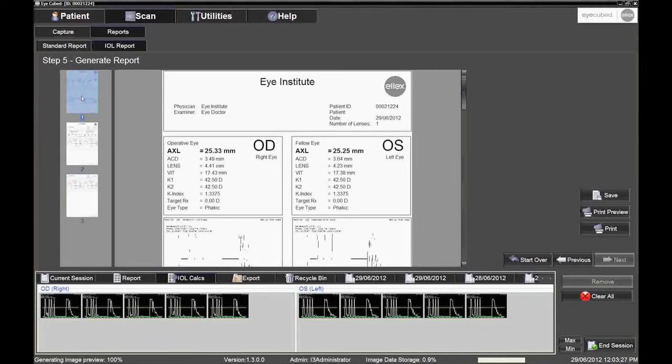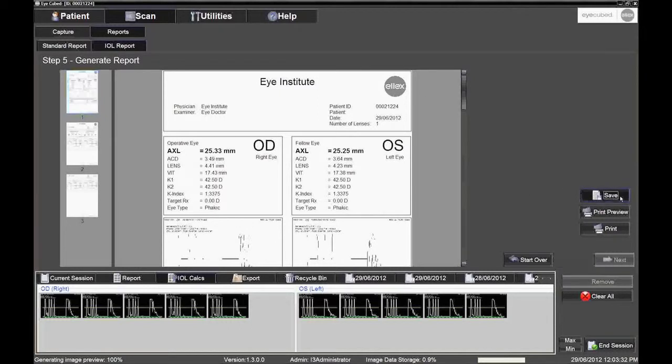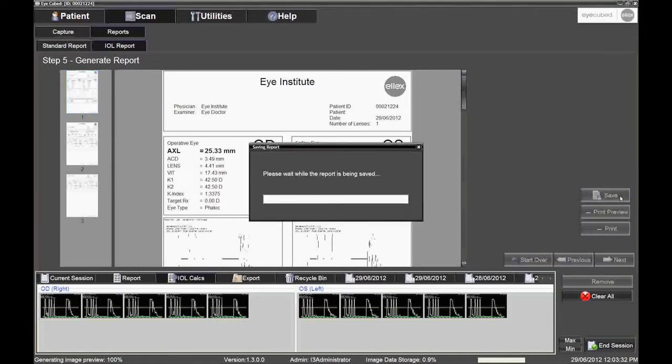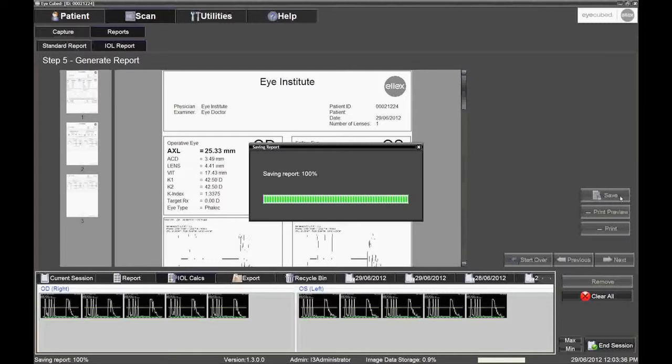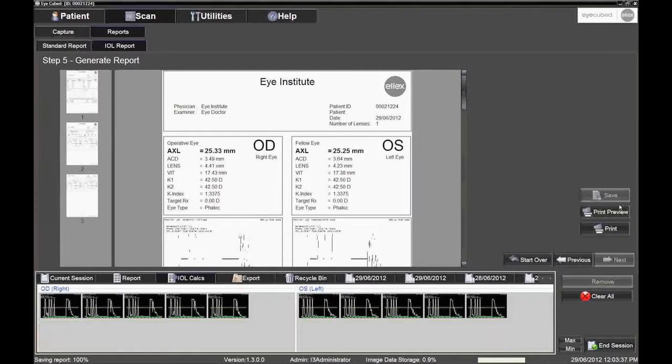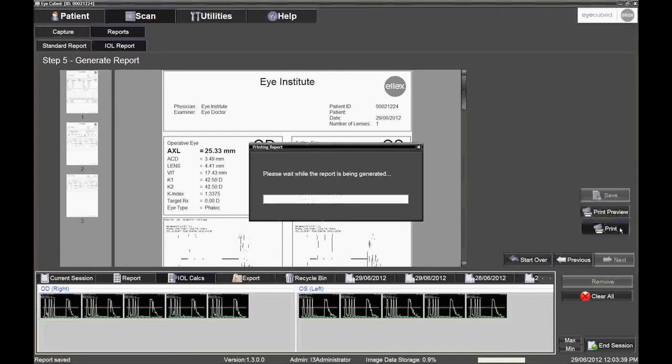If desired, Print Preview may be selected or the report may be saved for later review. The report may now be printed by pressing the Print button below the Print Preview button.